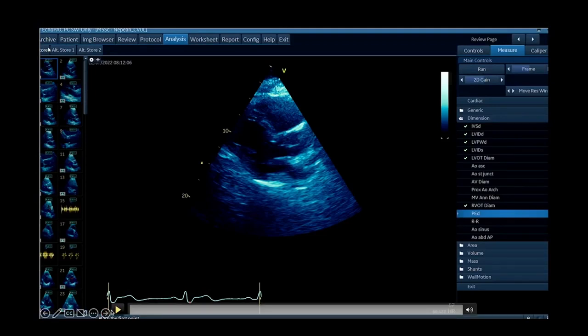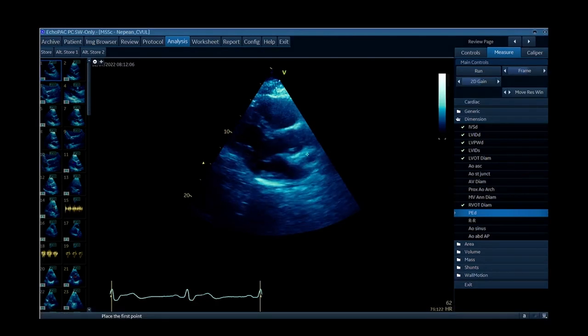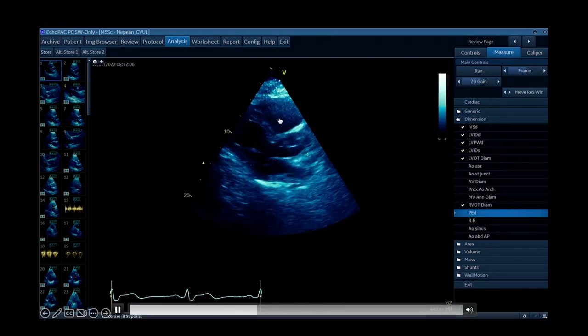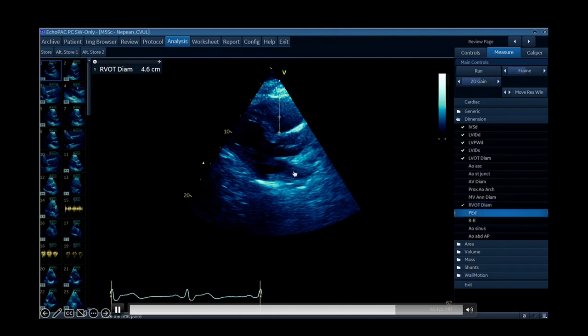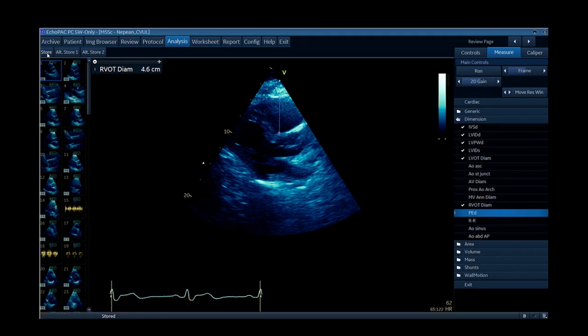In the parasternal long axis view you often have the right ventricular outflow tract at the top. You can measure it in that view. This is a parasternal long axis view — you can see the RV outflow tract at the top, the aortic valve and ascending aorta, and the left atrium. People do a visual assessment using the rule of thirds, and just eyeballing that RVOT can indicate whether it might be dilated. Catching this early can guide whether you need a more detailed assessment of the right ventricle.